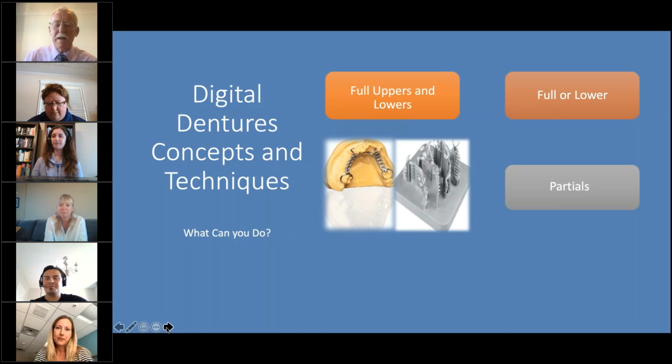They're beautiful. Are they milled in Canada? Yes, in Alberta. And I think George from Perfect mills titanium as well. If you get a mill, you can mill, but the pucks are quite expensive. But I think economically, if you've got a small frame, you could probably mill in house. But outsourcing to a milling centre or a sintering service is a very good idea.